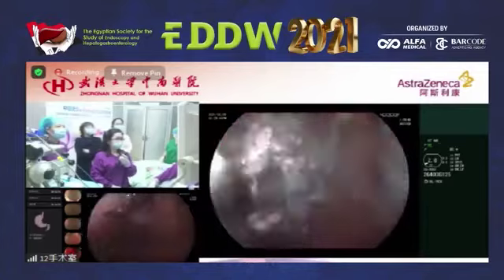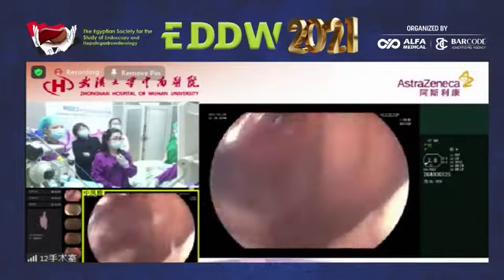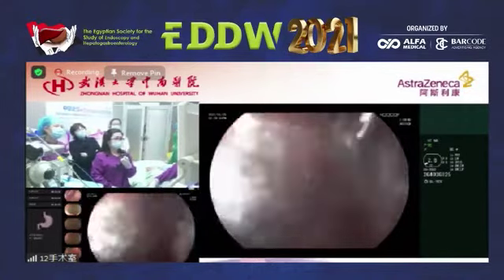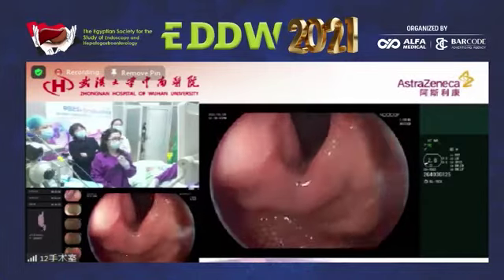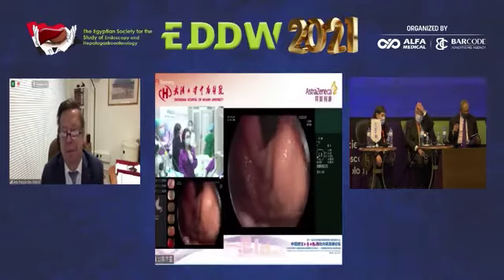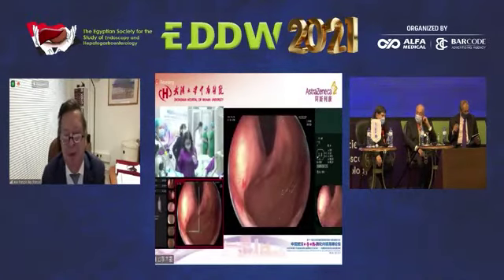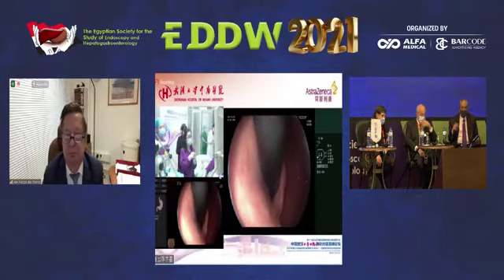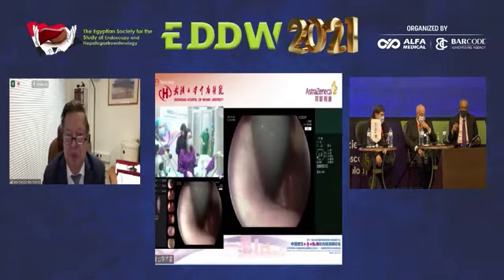For characterization, it's more important in the stomach for small superficial gastric carcinoma, especially to look at malignancy and delineation in order to do ESD. For a large tumor like that, routine Fujiscope with BLI and LCI are quite important, and artificial intelligence did not add quite a lot.